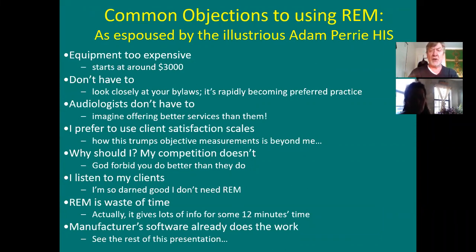I listen to my clients. I'm so darn good I don't need Real Ear measurement. REM is a waste of time. Actually, it gives a lot of info in about 12 minutes time. Manufacturer software already does the work. See the rest of this presentation.